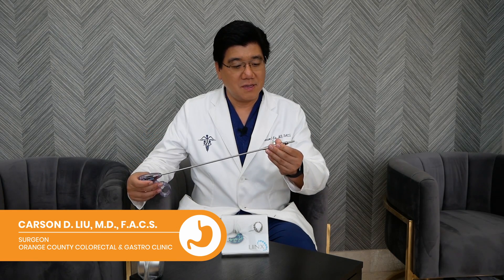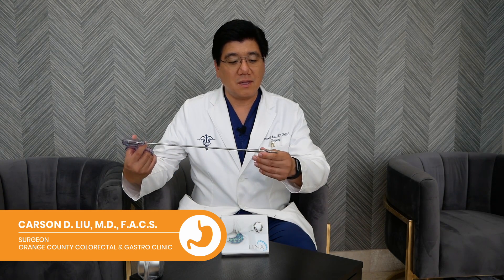Hello, it's Dr. Carson Liu. We're here to talk about magnetic surgery today and we're going to be using this device from Levita — a new FDA device to help surgeons operate in laparoscopic surgery.